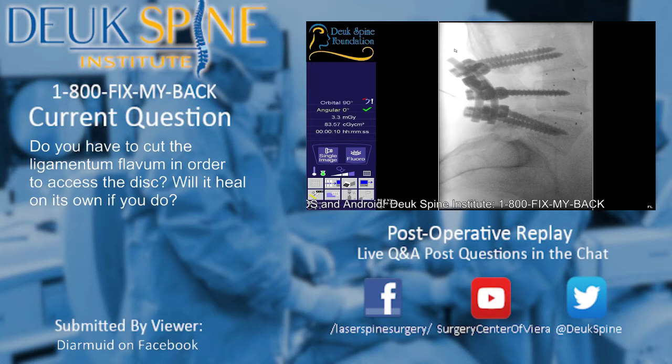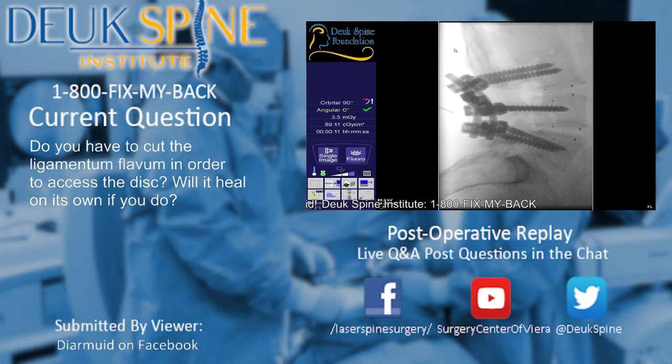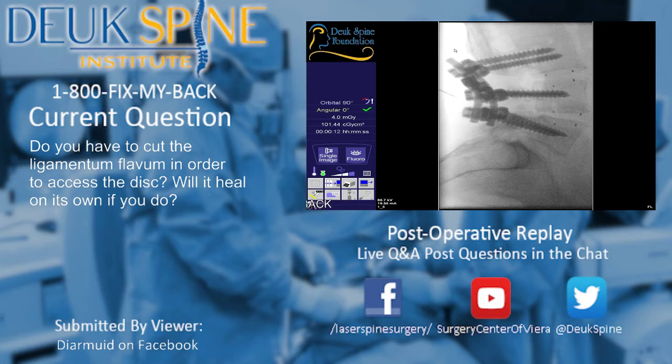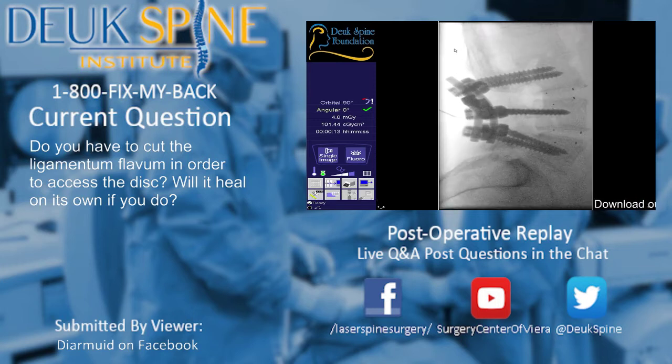So the ligamentum flavum does extend under the lamina out to the facet joint and even into the foramen, where it becomes the foraminal ligament. So the answer to your question is no. With the Deuk Laser Disc Repair procedure, we are approaching the disc through the outside of the foramen, the opposite side of the foramen than a microdiscectomy would.